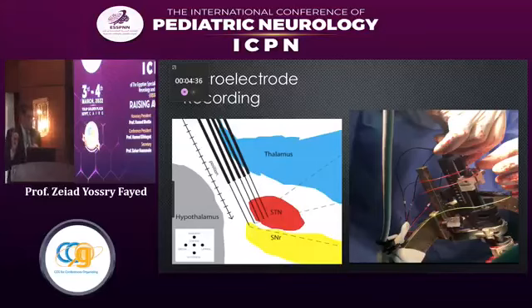The first electrode which enters the brain is the microelectrode. It is a very, very small electrode which functions to detect or record the firing of structures along the trajectory which we have chosen. This is called microelectrode recording, and it serves to improve the accuracy and confirms the physiological correlation of our anatomical target.